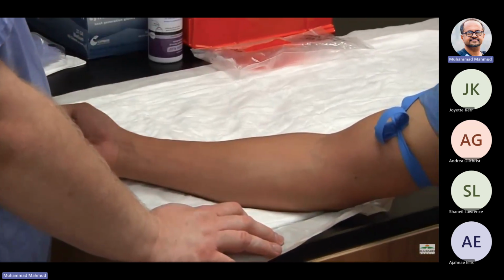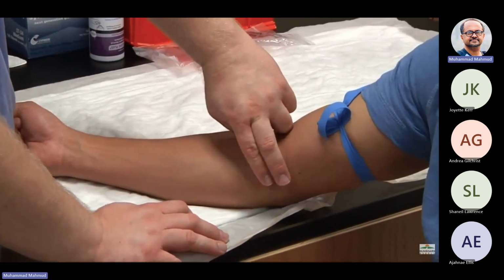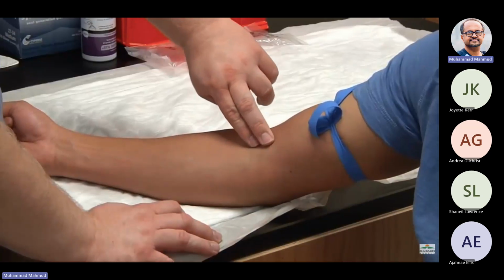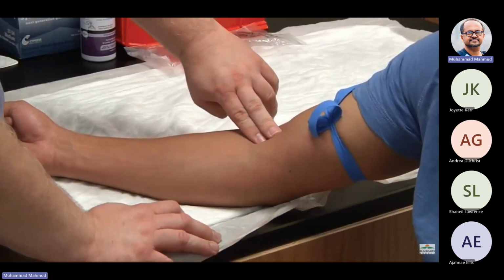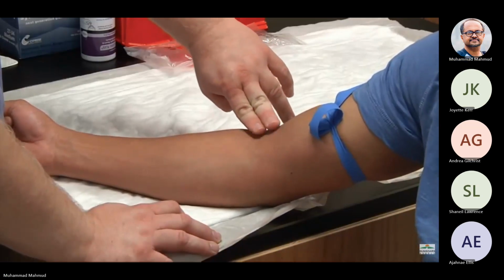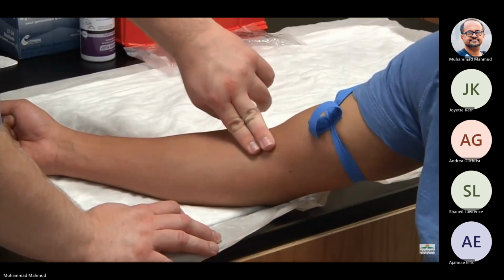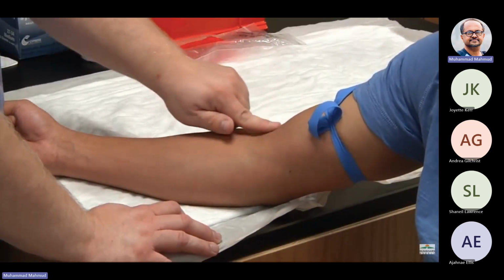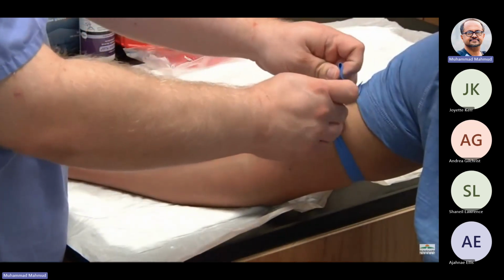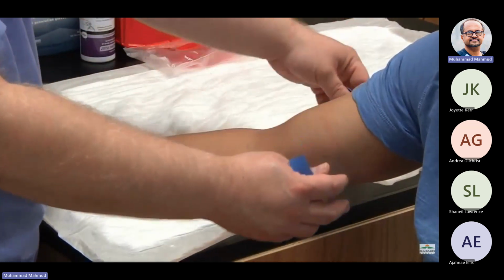With the two index fingers of your non-dominant hand, start from one side of your patient's arm and palpate, pushing in and down, moving gently across. Your first sweep, you're just seeing what your patient has, and then you'll pass through again, determining if you have a vein, artery, or tendon, and choose your selection site. With this patient, I'm going to go right here with this vein. Then you'll release your tourniquet and prepare your supplies. And this is tourniquet application and palpation.